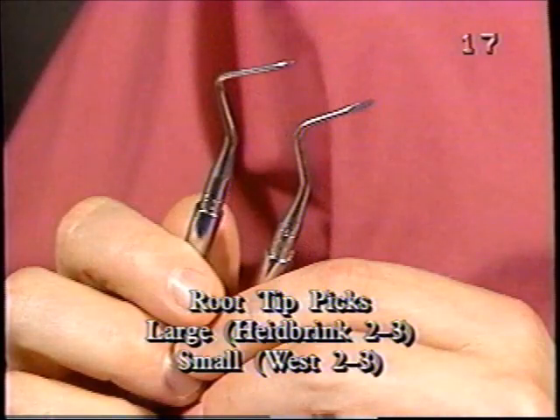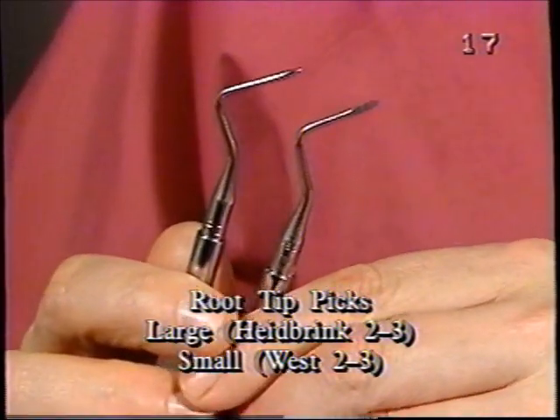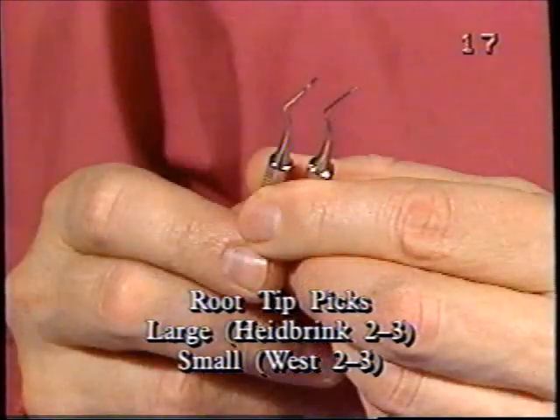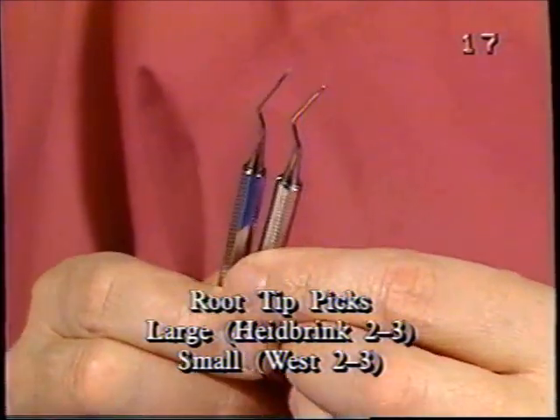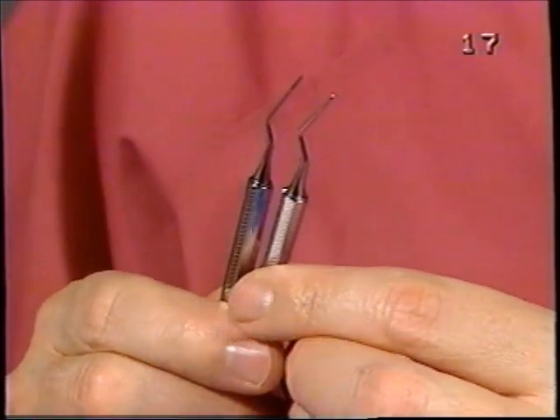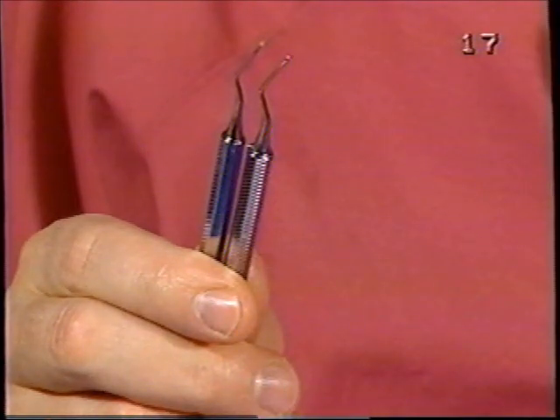Root tip picks. We definitely need root tip picks, but let me say not just one set, but rather 2. This is the larger variety. These are the Heidbrink 2-3. The other set would be the West 2-3, and you may have your own numbers and own examples. Notice how delicate these are. For a very tiny fractured root, maybe a couple of millimeters long, where you need something more delicate than the ones I just showed.